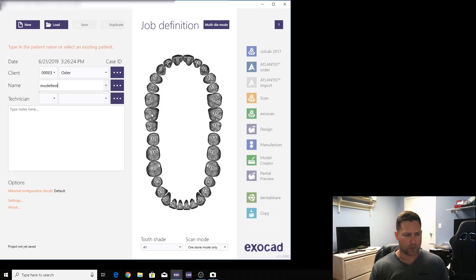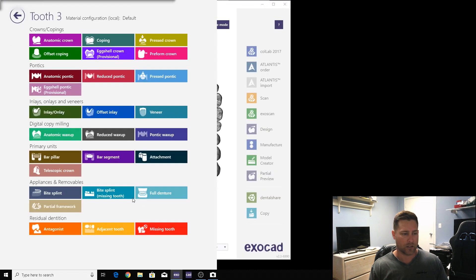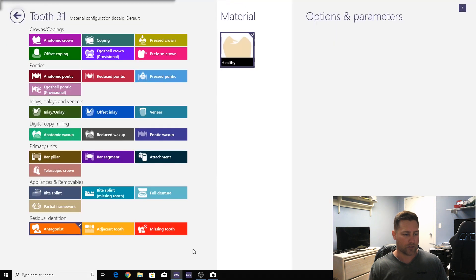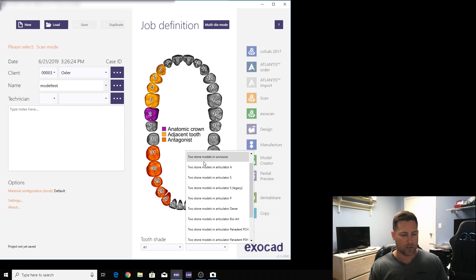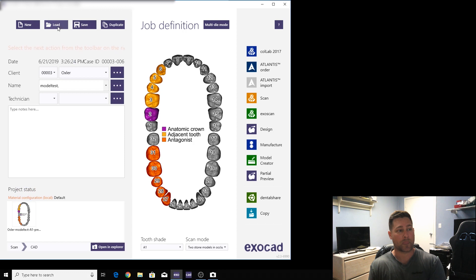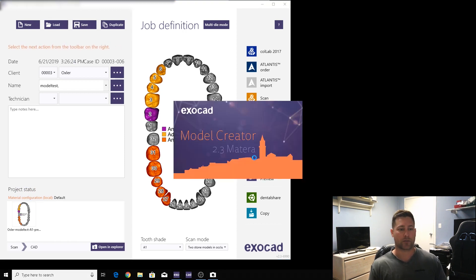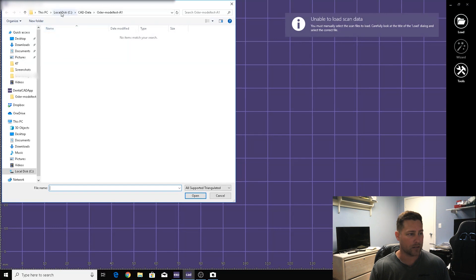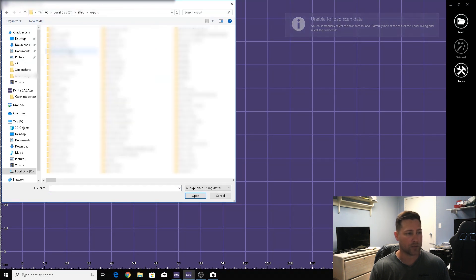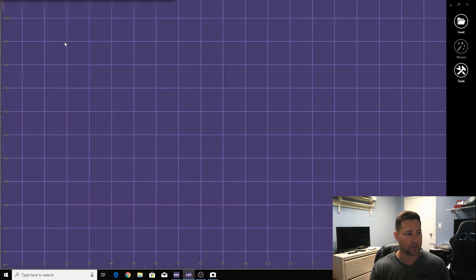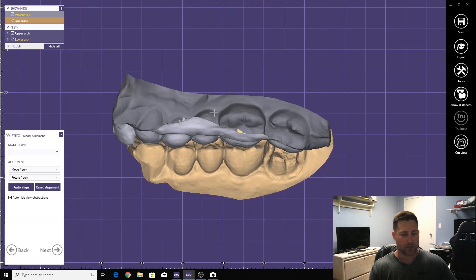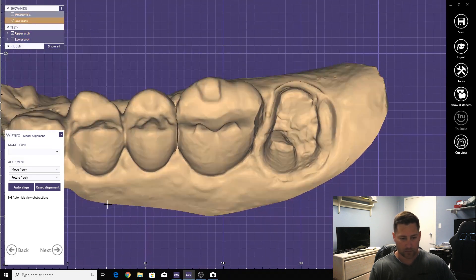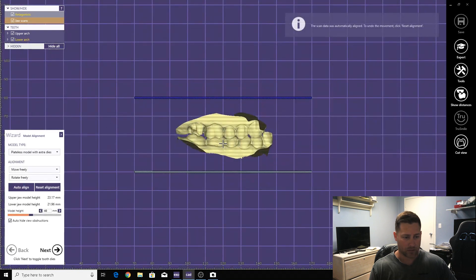Alright, now we're doing number two. I'll show you how to import the STL. Instead of going into the Load and loading iTero, come straight over to Model Creator. It'll ask you to import the actual files and they will be in their normal state. Go find the data — go into your C drive > iTero Export > Test. Upper jaw: load first. Lower jaw: load second. Now you can see that everything is back the way it's supposed to be with extra dies.